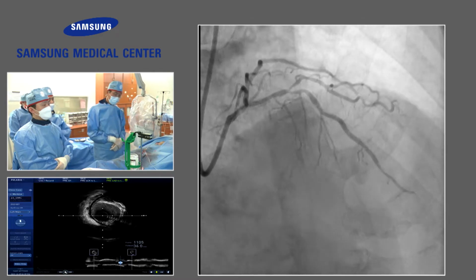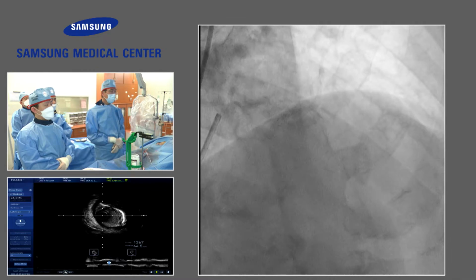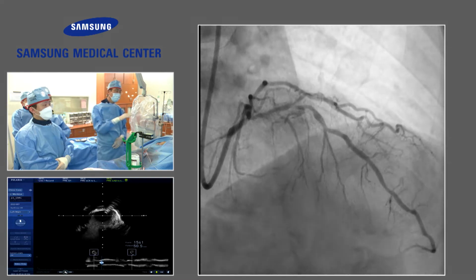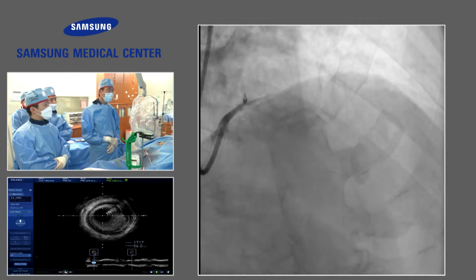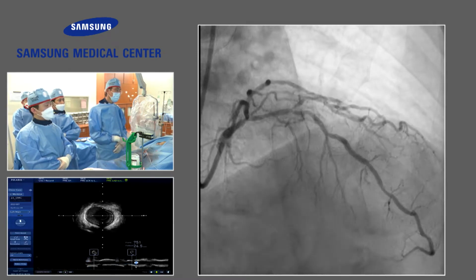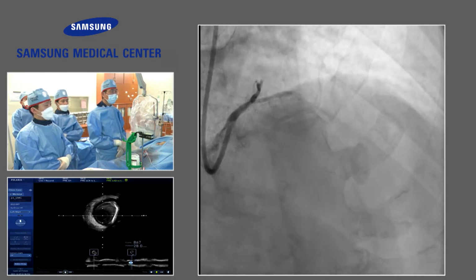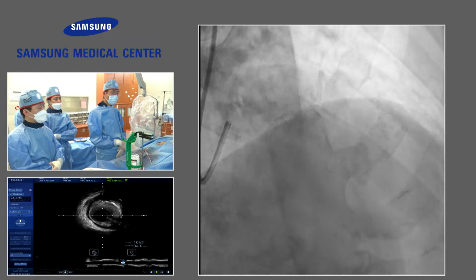My plan is just to finish with one stent technique, but given the size discrepancy of the mid LAD to proximal LAD, I would put a 3.0 stent from the mid to proximal LAD, and treat the circumflex with a balloon. Maybe we need a predilation there, and I don't think DB is working here because the vessel is very short, very small. Then put the 3.5 stent across the left main, and for the circumflex I tried to finish with a drug-eluting balloon. The issue is that I don't use the kissing balloon.